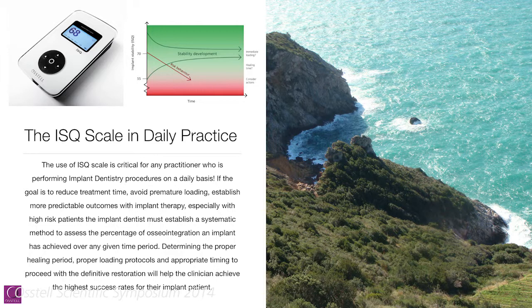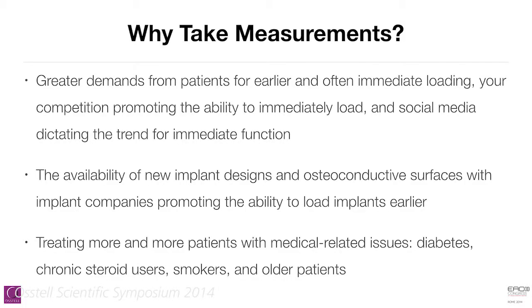And if you've ever attended any of my training courses or my advanced clinical training program at UCLA, you know that every single implant that I placed over the last 15 years have been measured with ISQ. And at this point, the reason why I take these measurements is because we are seeing more demands from our patient as far as earlier and earlier treatment times.